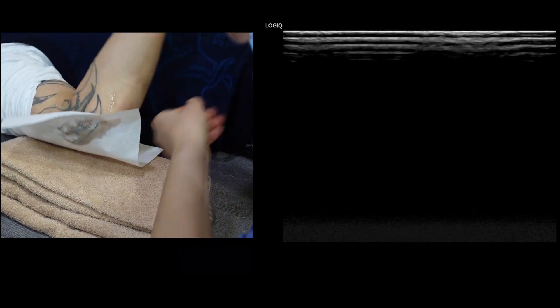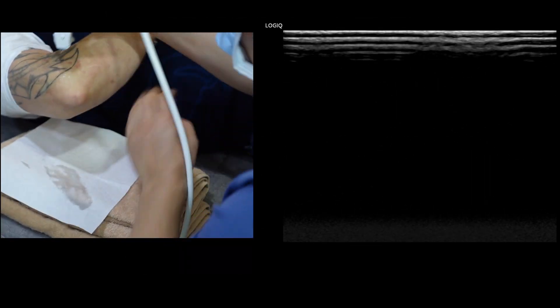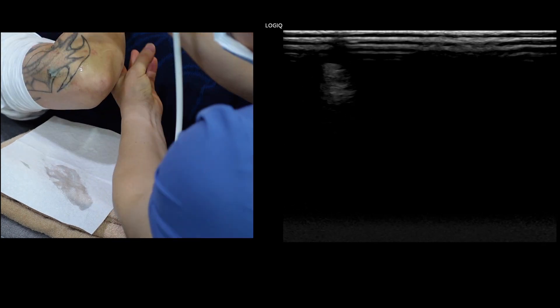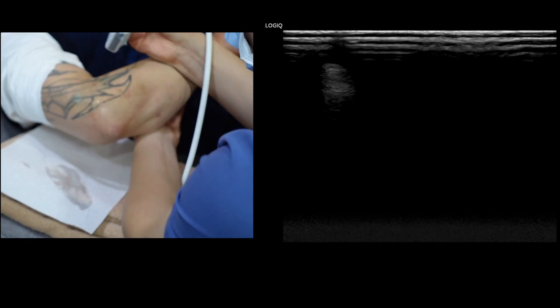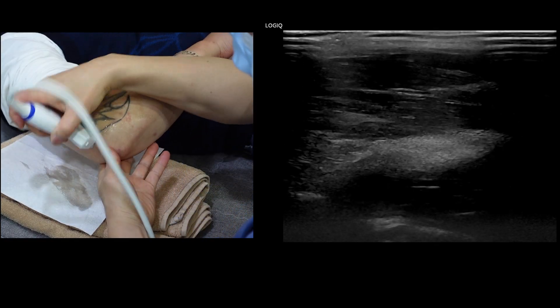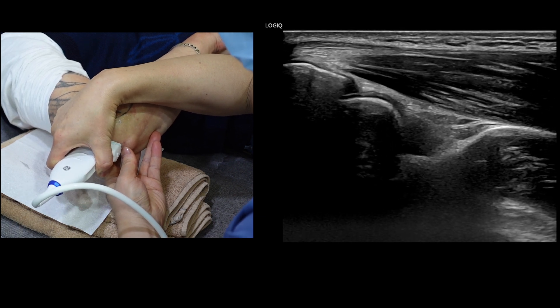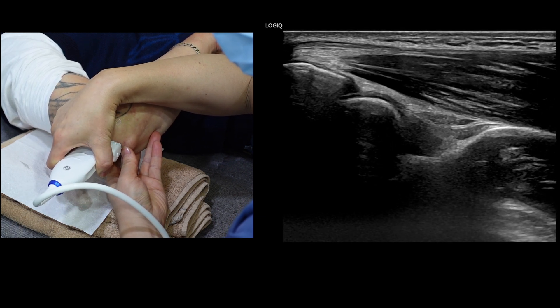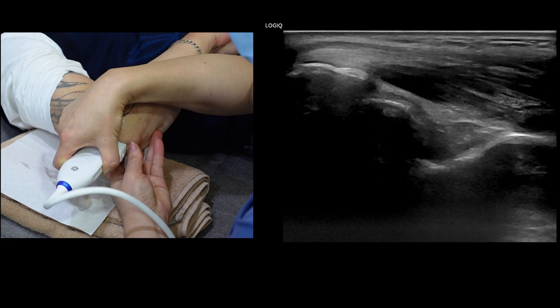Lastly, we will evaluate the olecranon fossa and any effusion present, along with some aspects of the triceps tendon, the anconius muscle, and the posterior lateral capsule of the humororadial joint.